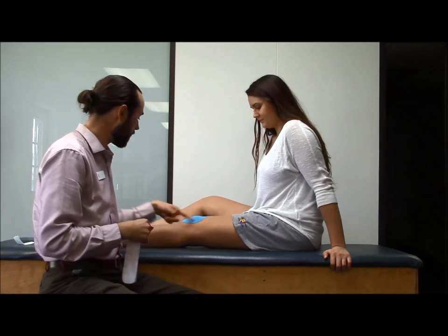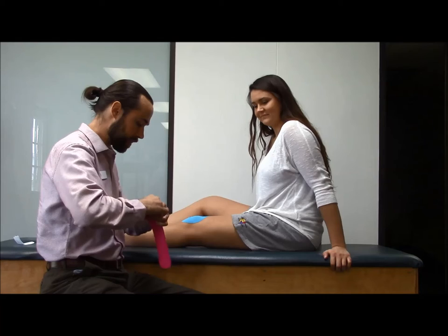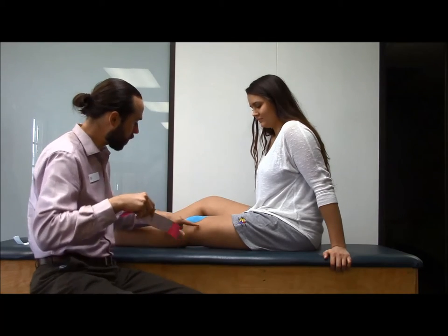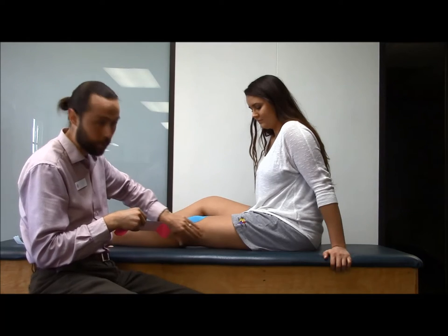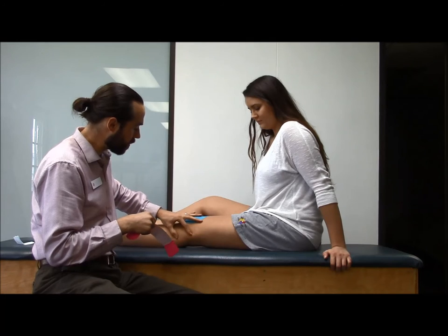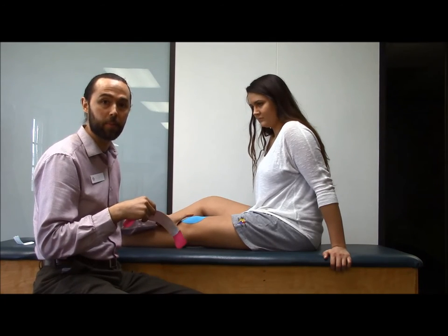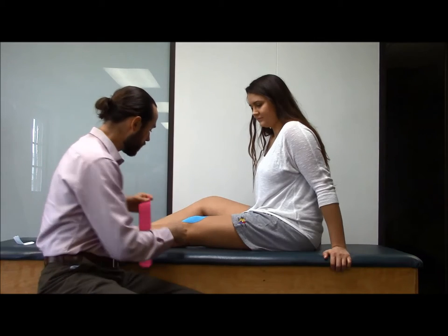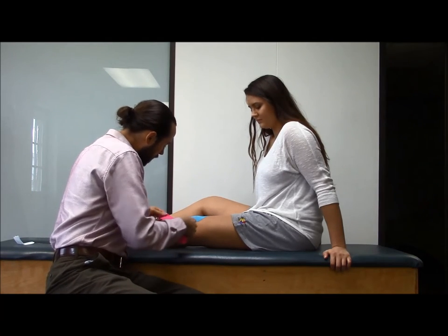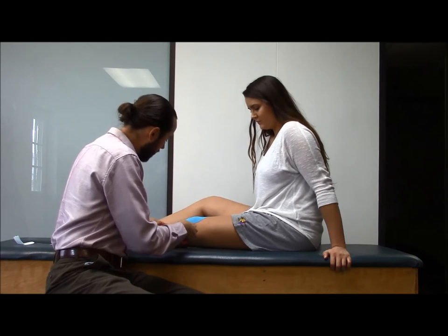The next one I'm going to show you is how to support the ligaments on the inside and outside of the knee. Since it's easier to see from this angle, I'm going to do the outside of her knee first. This is the ligament that connects her femur bone here to her leg bone down here, and the ligament is right around here. So we're going to find the ligament down here and start the tape over here. When you anchor it, you don't put any tension on it.